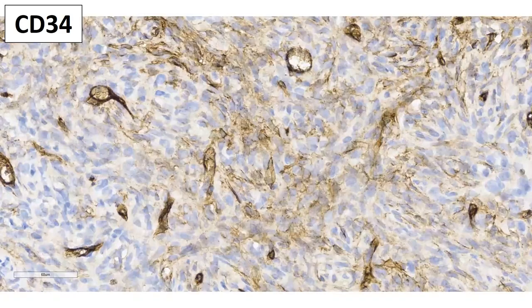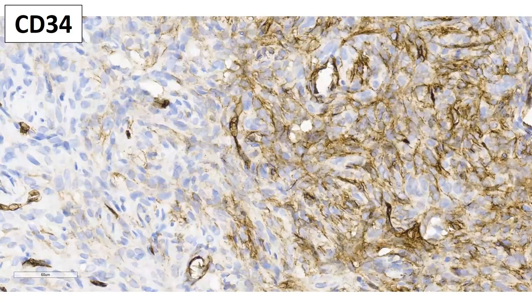We said it was purely negative. Then we got it doesn't have to be negative. It can be like this. So you can see in this particular tumor, it's patchy. See the blushy stuff? Let's go up to higher power. And you see in the center of the field, that staining is actually labeling the tumor cells themselves, not blood vessels. Here's an even better example.